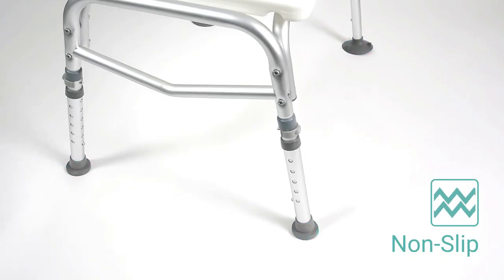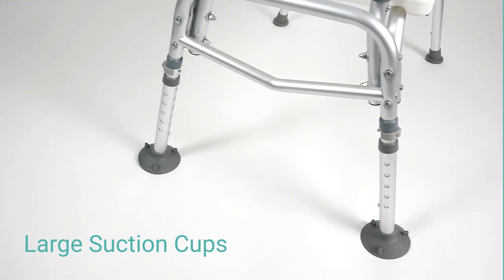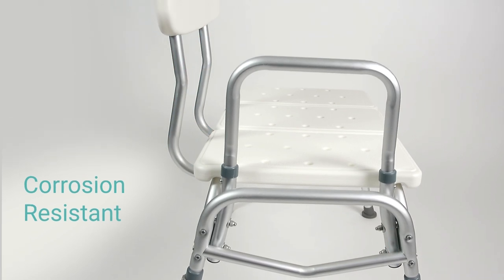Outside legs are capped with non-slip tips, while inside legs feature large suction cups to ensure the bench stays in place. Lightweight, corrosion-resistant material is easily cleaned and perfect for long-term use.